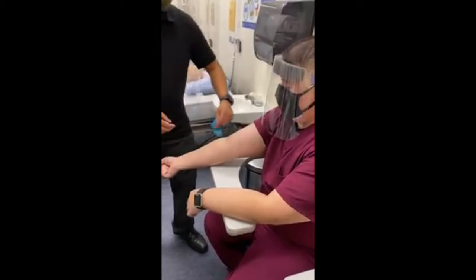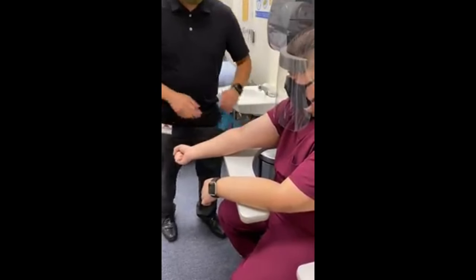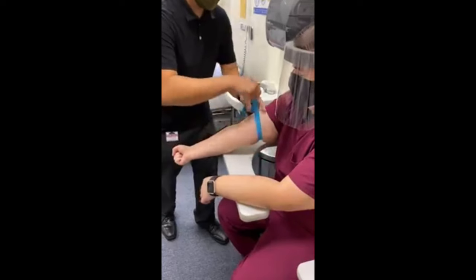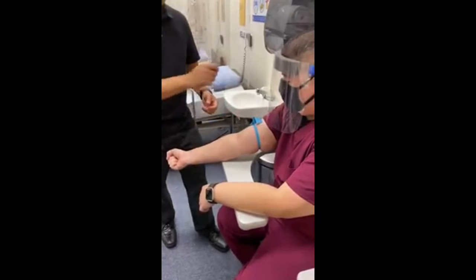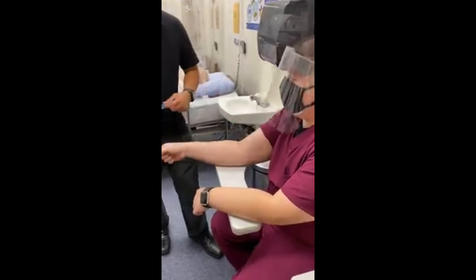Once you have the vein, then I would put on gloves, clean the site, make it dry. Once I have gloves on and the site is dry, then I would reapply it, and then get my equipment and then stick. In this case, you're just feeling for the vein. So just keep in mind.